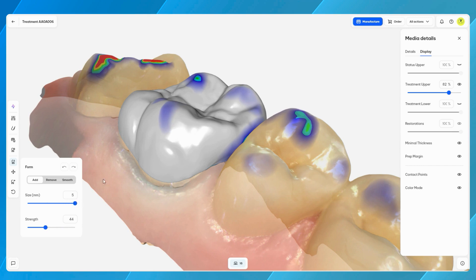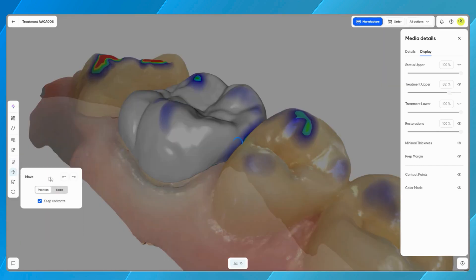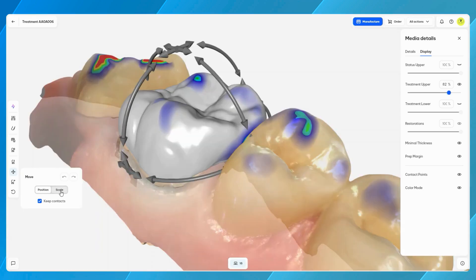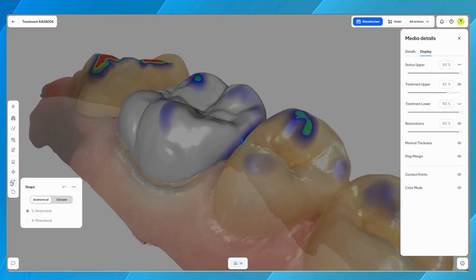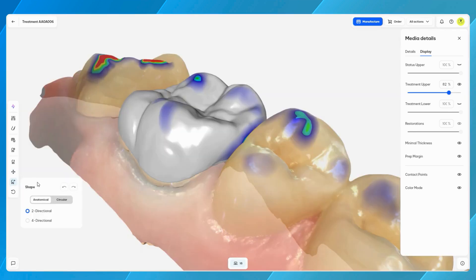These settings determine how large the area of influence is and how much material is added or removed in a single action. The move tool enables adjustments to the position and scale of the restoration. Users can select the position to move the restoration across different angles and orientations. Alternatively, selecting scale allows resizing of the restoration, making it larger or smaller along various axes and directions, providing precise control over the placement and proportions of the restoration within the digital model.